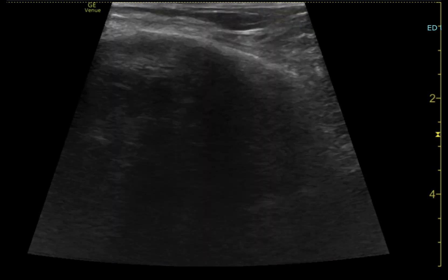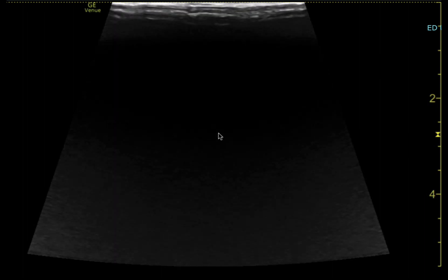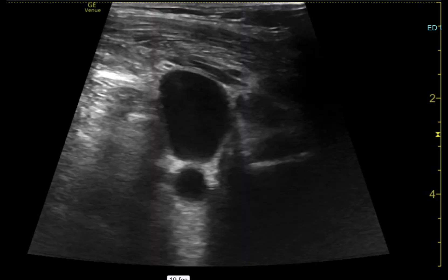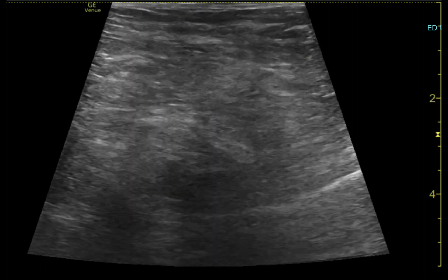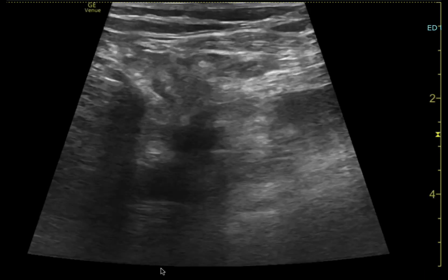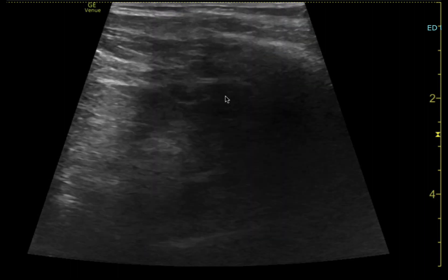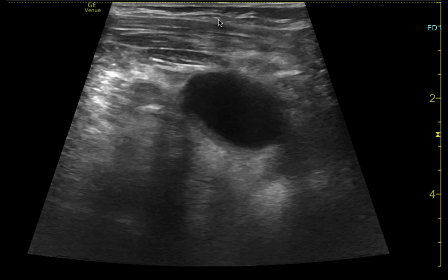We track the wire up into the IJ and confirm we don't see a wire there — that's an important step. There's no wire in the IJ, so I feel good about dilating and continuing the procedure. We can see the wire heading toward the subclavian vein, giving us evidence it is not in the artery, so we're safe to dilate and continue.